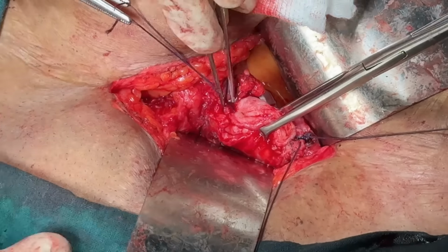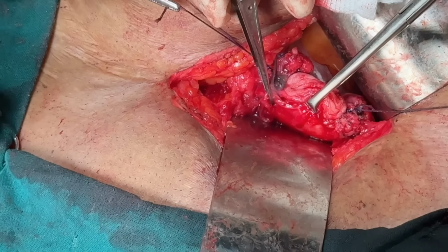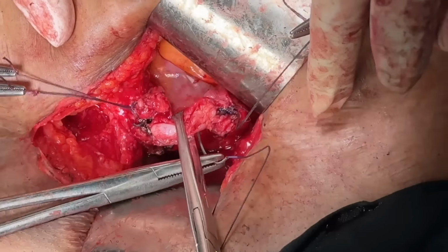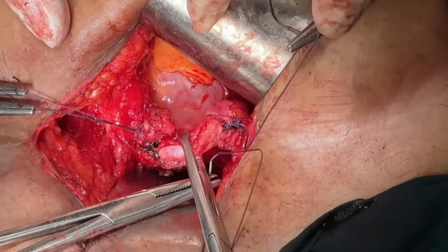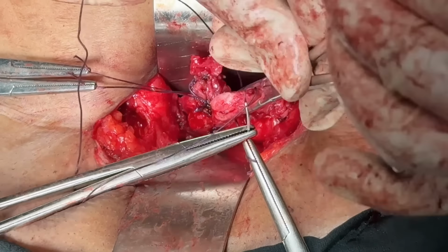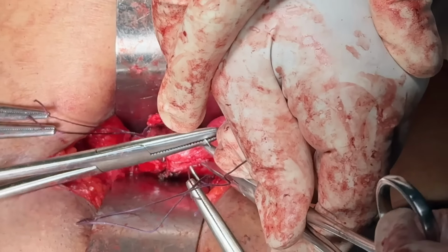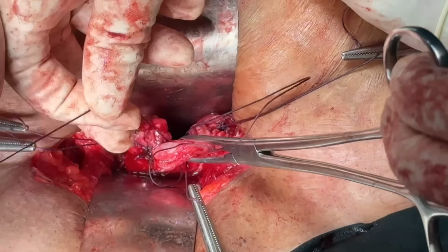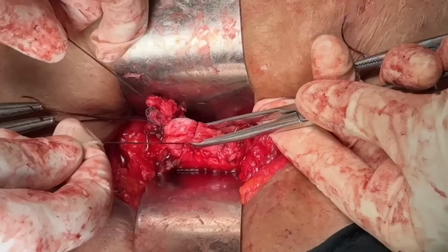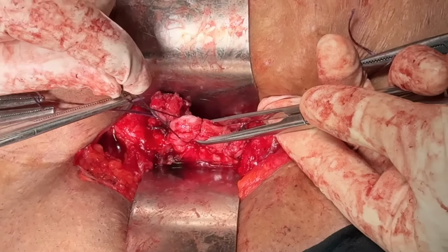Now, if you feel the need, the center part can also be sutured. You may take a single vault suture or you may go continuously also. You can do whatever you feel like. Ultimately, the purpose is to close the vault. So here what we are doing, we have taken two angles, done the vault suspension, and the middle part which was remaining, we are taking a figure of 8 suture here. Figure of 8 suture helps for hemostasis as well as helps the closure of the vault, approximating the two vaginal walls in the middle part.